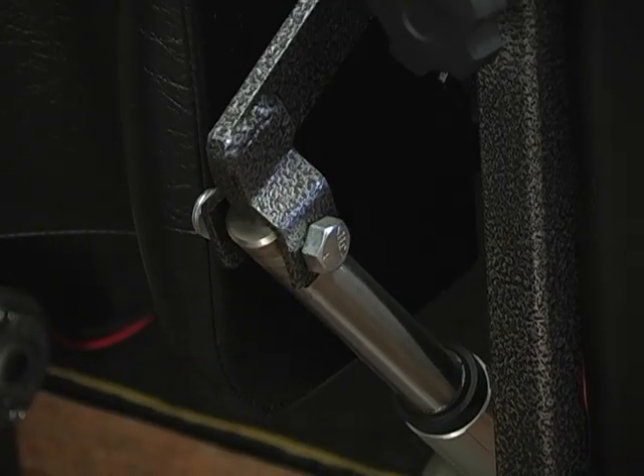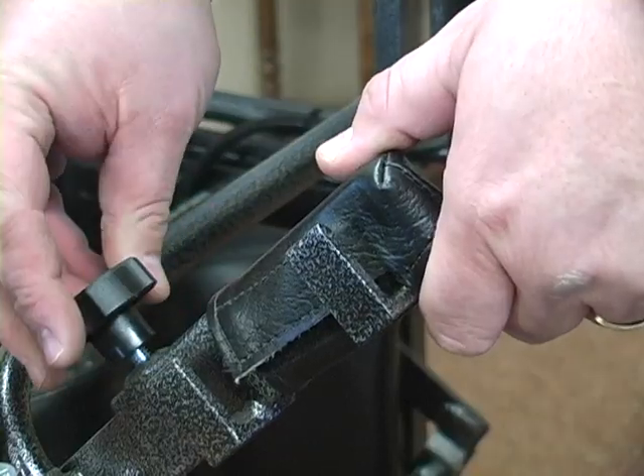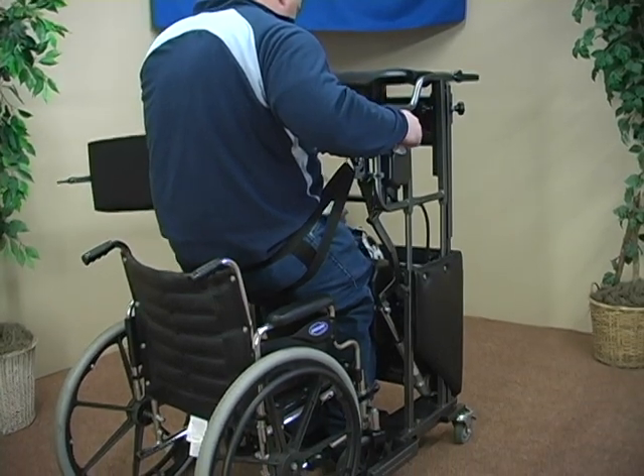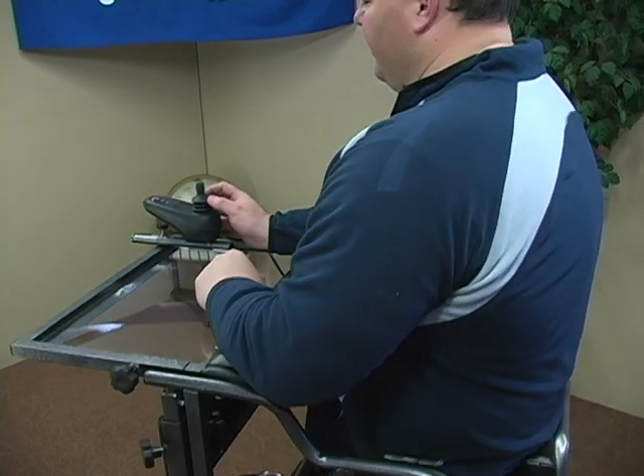The lift is operated by a toggle switch mounted on either side of the frame. A variety of sling sizes and styles are available with each Stand-Aid lift. This Stand-Aid frame will accommodate users 4'2" to 7' tall and a weight limit of 400 pounds.